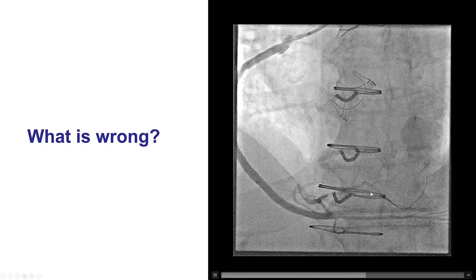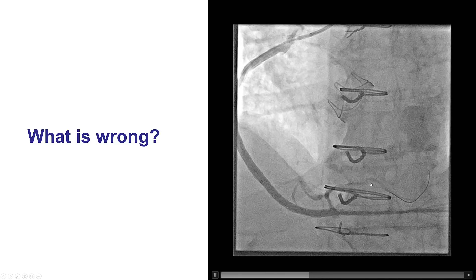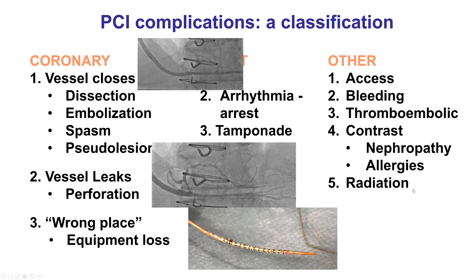The wire was in a small branch and likely out of the vessel, creating significant concerns about perforation. Fortunately, we did not have perforation with extravasation on the next image. This case illustrates the likelihood of complications — we had all three types of coronary complications: acute vessel closure likely due to dissection in the proximal PDA; wire perforation, which fortunately did not cause continued bleeding and tamponade; and we almost had equipment loss with the stent being deformed, though we were able to bring it back before it was stripped off the balloon.